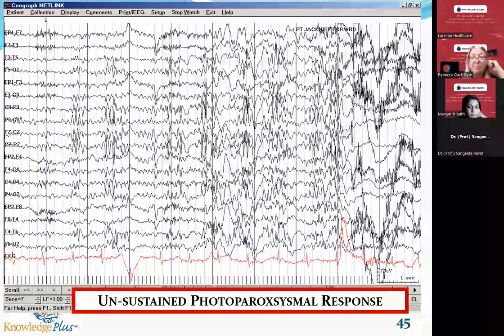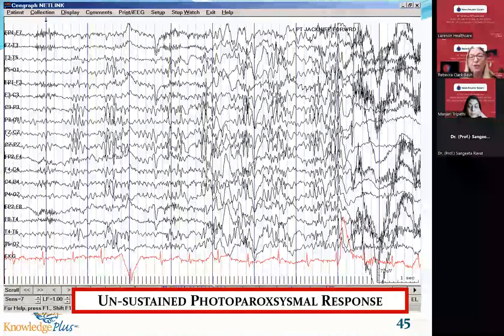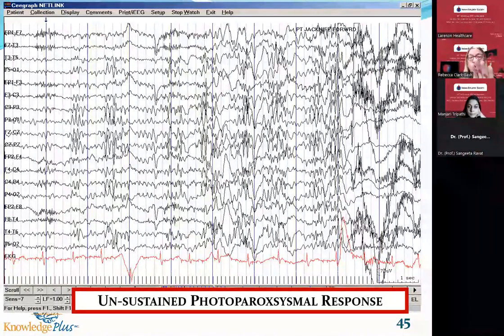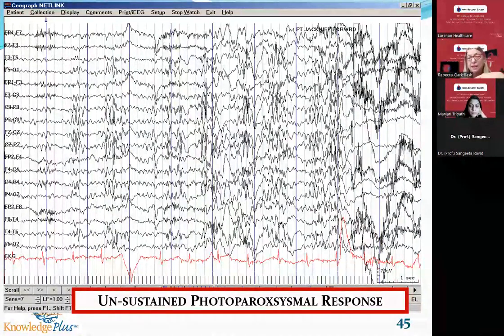None of that high amplitude activity was present throughout his entire EEG. So this morphology is unique to the stimulation. Now, me personally, as soon as I saw the activity in two and three, I would have shut that stimulator off. Now, that didn't happen. Remember, I'm not there teaching that tech. I'm there teaching new techs. She is an experienced tech doing this recording.